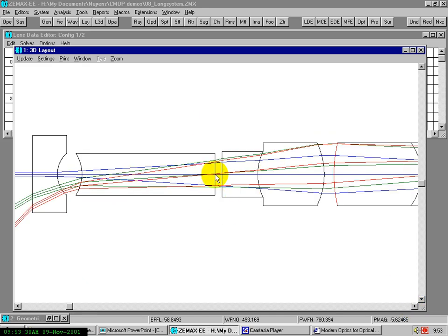Here, at this position, we do have the aperture stop, because all the principal rays pass through the optical axis.